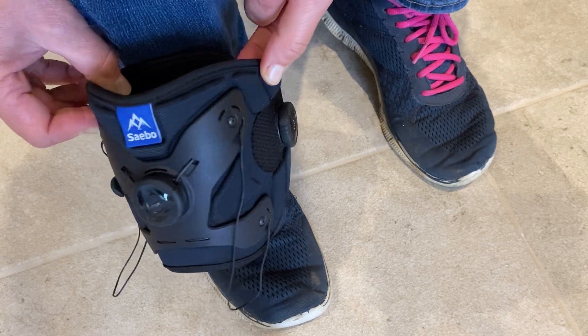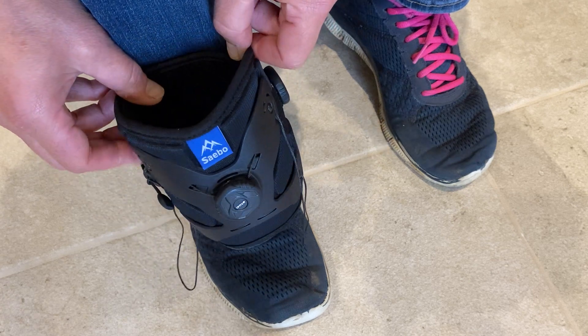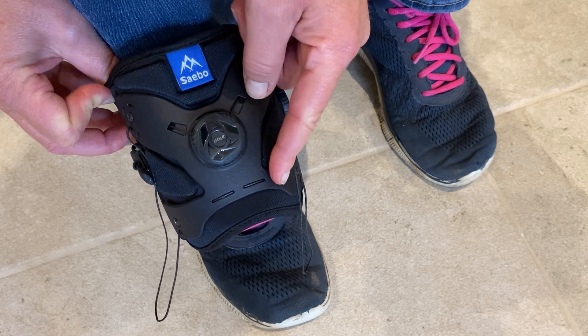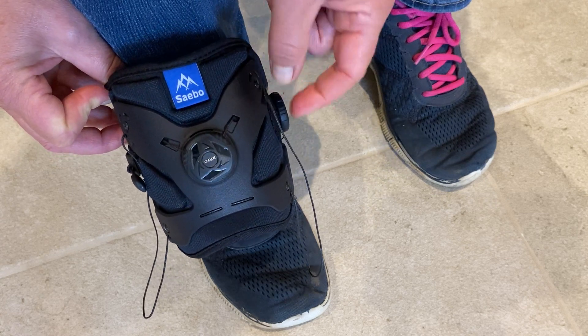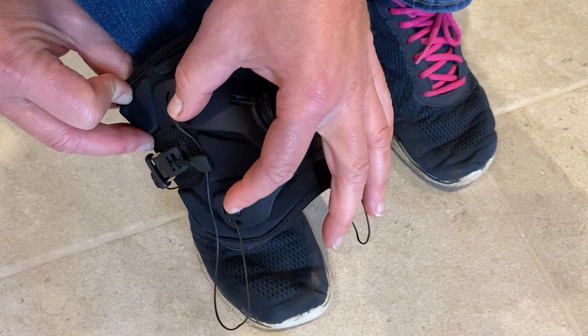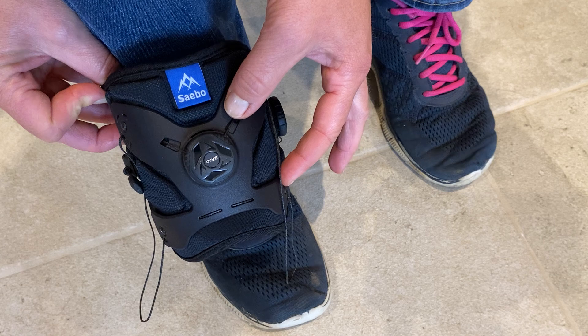The cuff itself is more padded for comfortable wear throughout the day, and the bow dial at the front is now part of a plastic fascia system. So if the cord is required to be replaced, it's just a case of unscrewing these four screws and replacing the whole plate in one go.